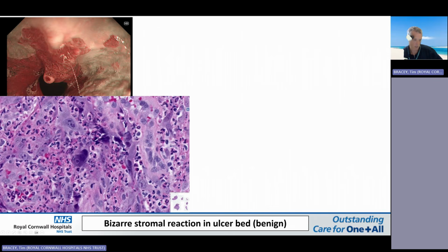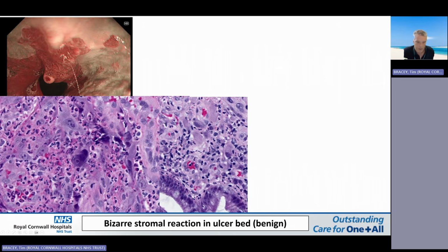Often I find they have a lot of eosinophils and other granulocytes dotted around, and the cells, if you start getting used to these almost smudgy purple blue cytoplasm that comes off these reactive myofibroblasts, these are completely just little inflammatory polyps that for some reason have bizarre stromal cells within them.